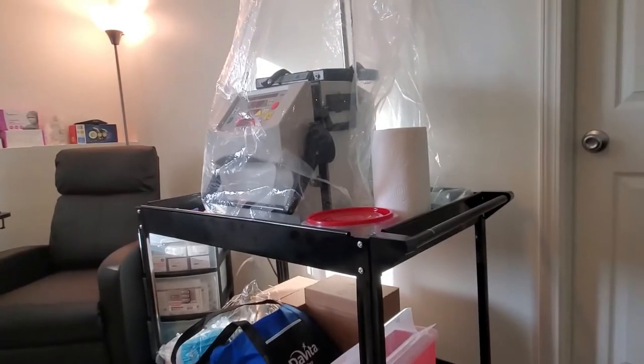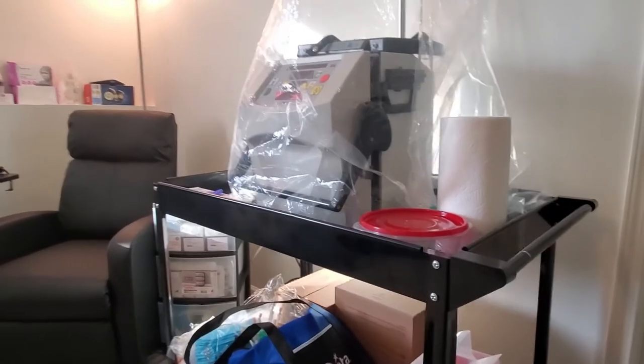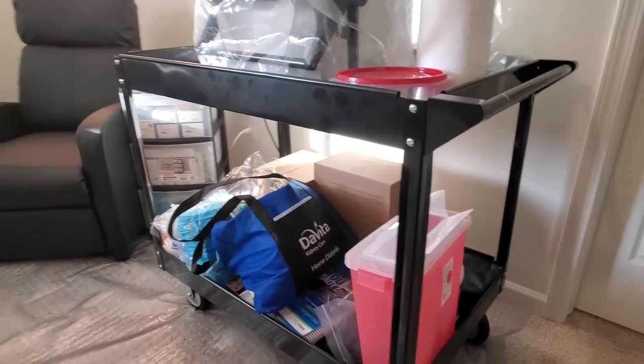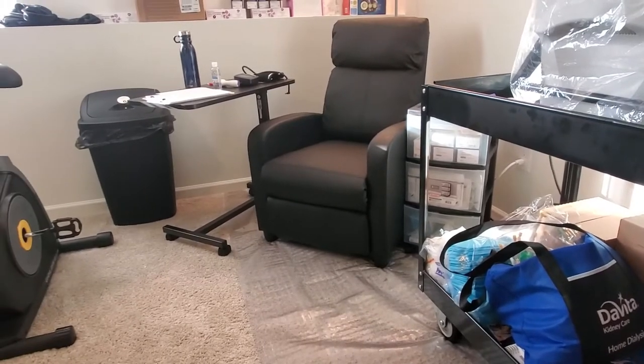What's up YouTube, this is your boy KJB. Like I said, this is my setup. You'll see my NxStage dialysis machine, some of the supplies, a little chair to sit in, a little work table.